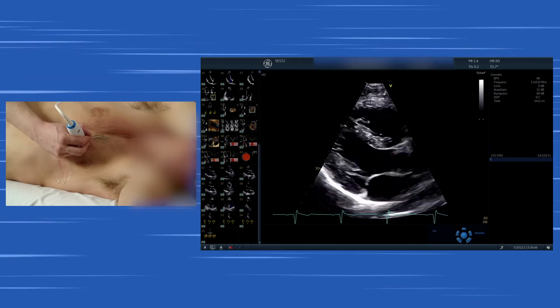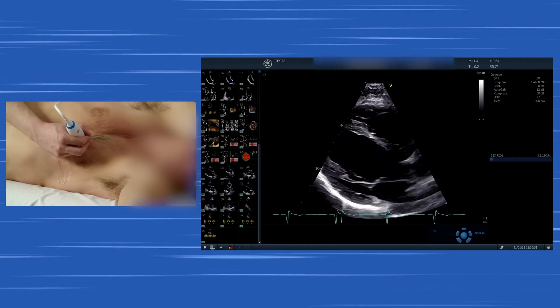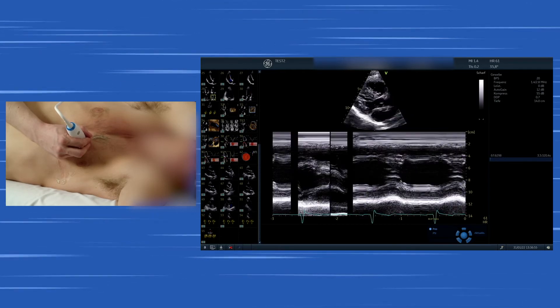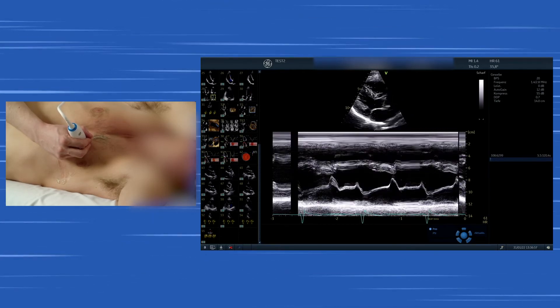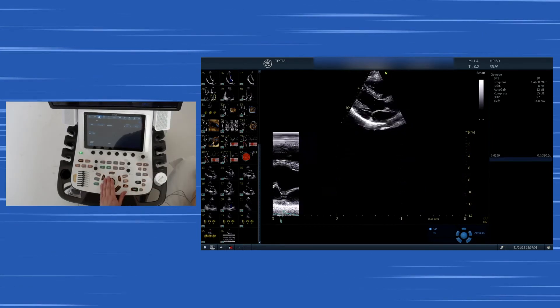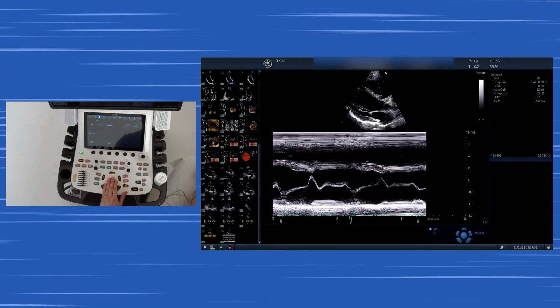Now we want to start with the M mode. The M mode can be used on several planes in the parasternal long axis. This is the view of the mitral valve. We also can take a look at the aortic valve and visualize the aortic valve in the parasternal long axis view as well.